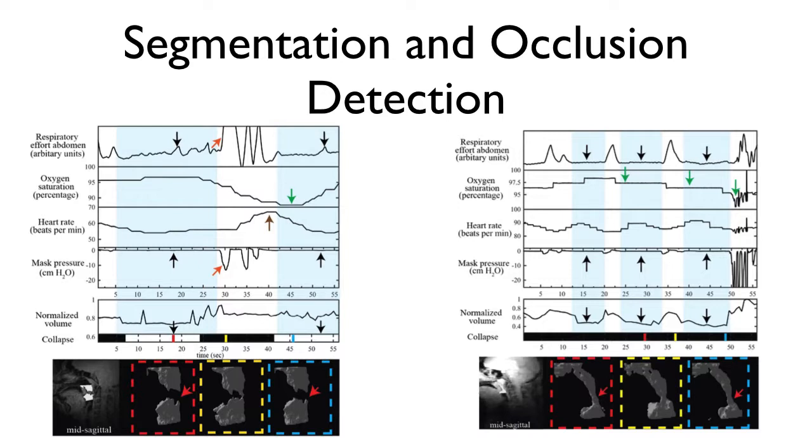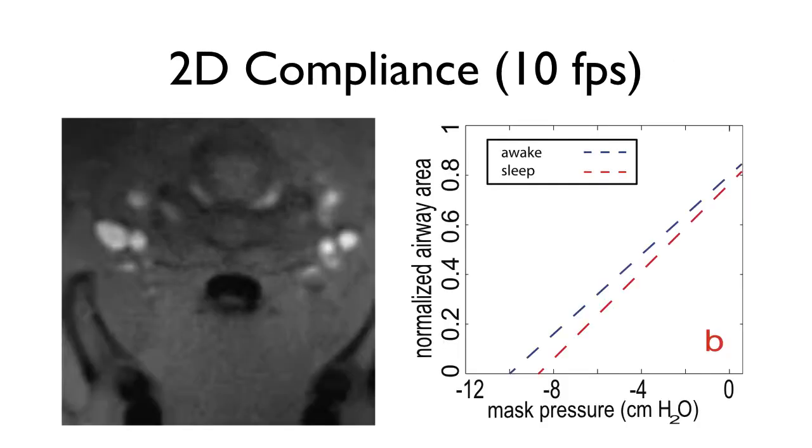This is also a different 14-year-old male with a central apnea event. The blue indicates the event identified by the MD again, and there was no collapse in these cases. So we believe this might be a way to streamline the processing of our 3D real-time movies.